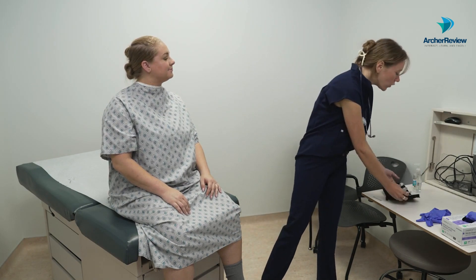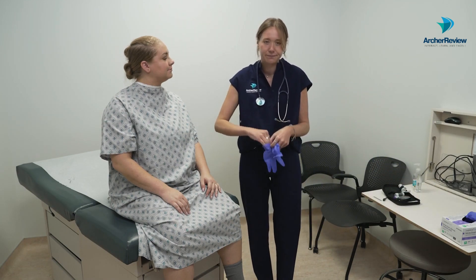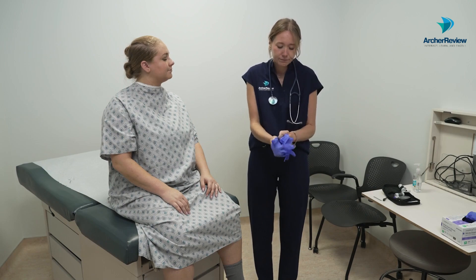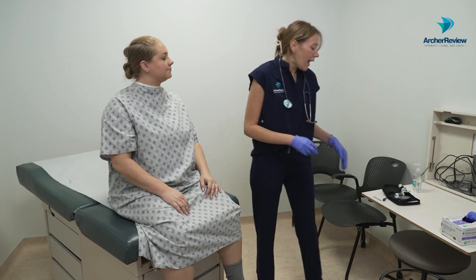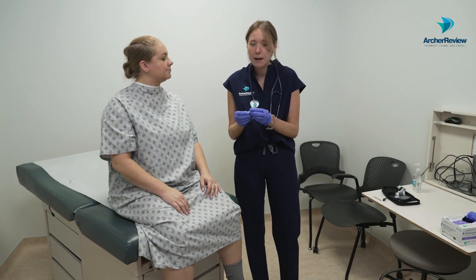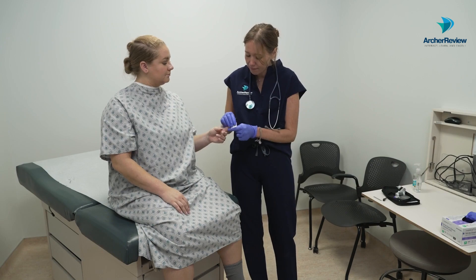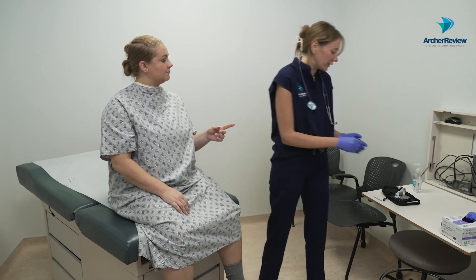Now that you're ready to go, you can perform your hand hygiene and don your clean gloves. At this point, I'm going to go ahead and clean the finger so we can let that air dry while we set up the rest of our materials. Can I borrow that finger from you? Give it a good scrub and then let that dry entirely.